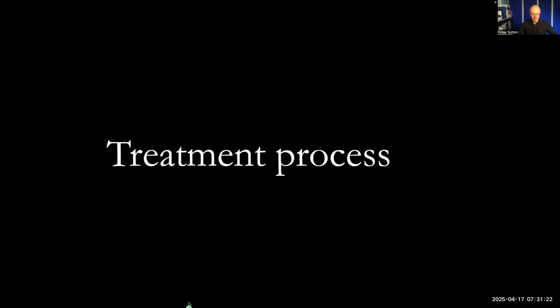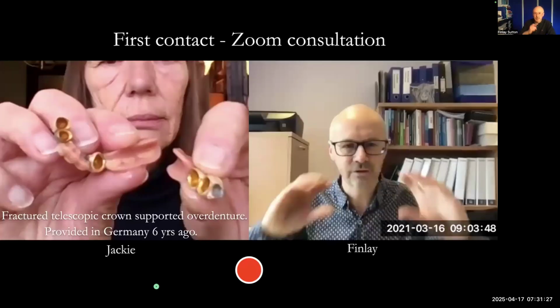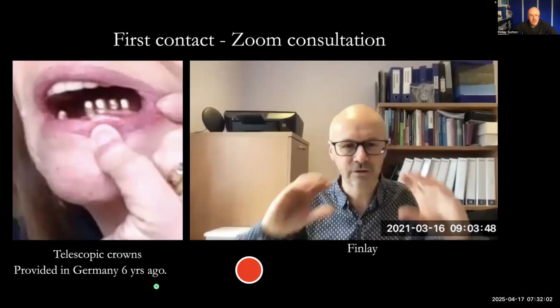So this is a treatment process. I saw Jackie in 2021. This is when she presented, and literally just after COVID, and I'd started doing my Zoom consultations then, which I found really useful. You can see we've got Jackie here. She used to live in Germany and had this work done 6 years prior to 2021. And she's got this lower bridge, this lower implant supported, telescopic crown supported overdenture that's broken. It's porcelain, gold, and plastic. And she can show me this.